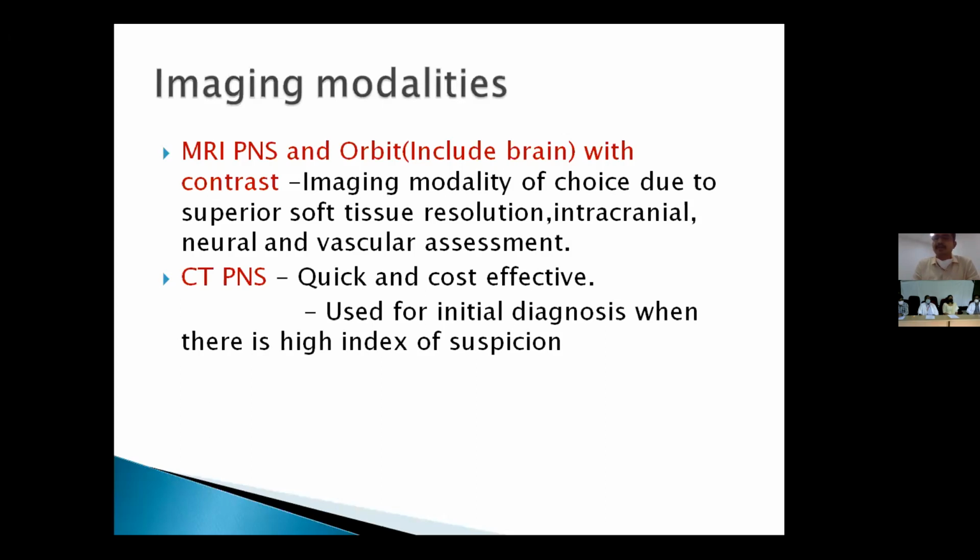CT of the PNS is available everywhere. It is quick and cost effective. CT can be used for initial diagnosis when there is a high index of suspicion in the patients, or only when there is extra sinus spread, we can assess using CT.